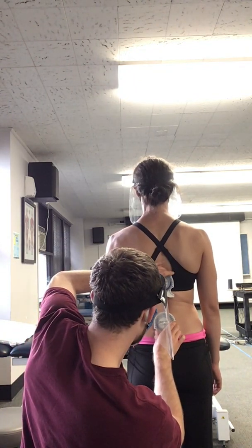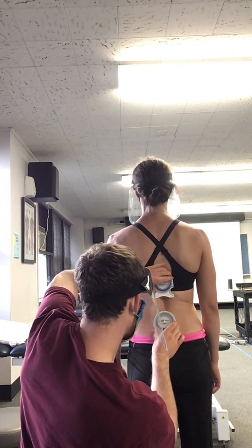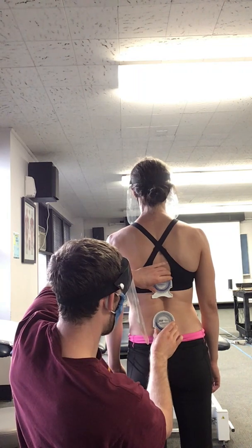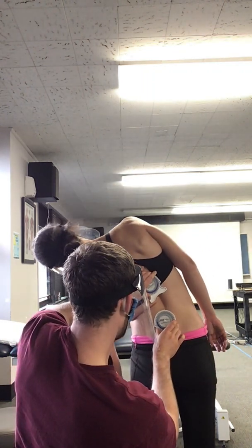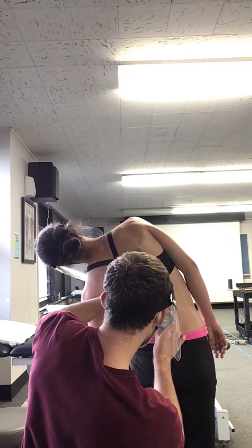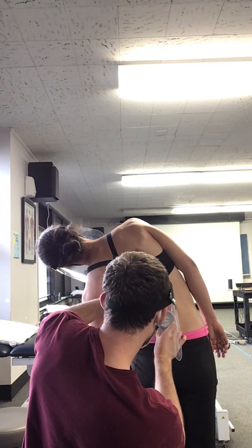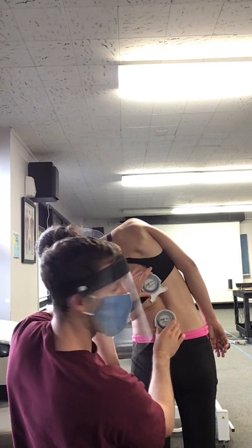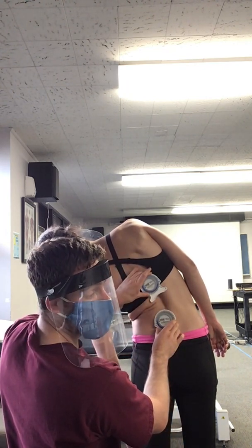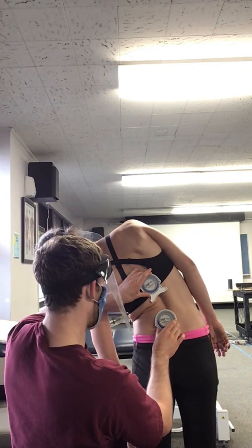And then before I do the next step, I'm going to make sure it's zeroed out again. All right, they're both zeroed out. And Jenna, I'm going to have you bend to the left. This side is about 35 on the top and five on the bottom. So again, subtracting 35 minus five, I'm getting 30 — so 30 degrees of lateral flexion to the left.